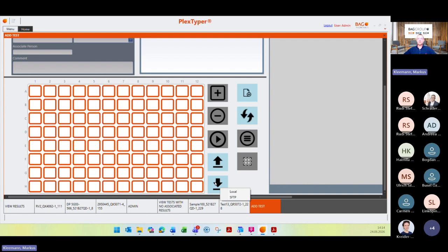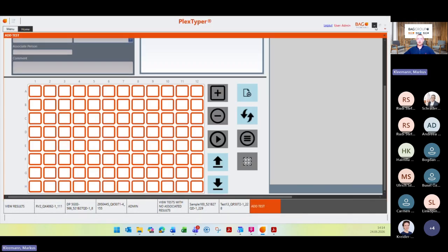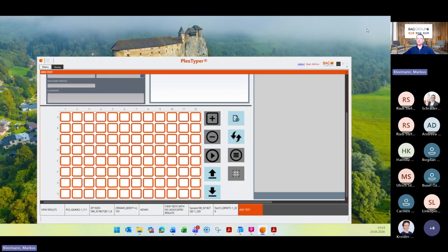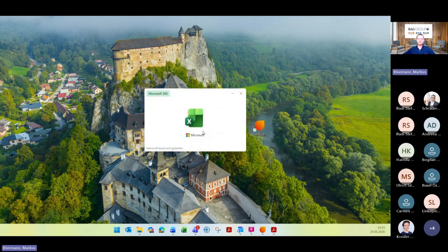You have the option to save this Excel work list on your local desktop, or in any folder, or you can do this on a secure server, which is secured by a password you have to choose. I will do this with this local server here, so just on my desktop, and use webinar 24/6. Save this. Then I just make this window here smaller, and look at my desktop for this Excel work list. So I just double click on this and open this file here.